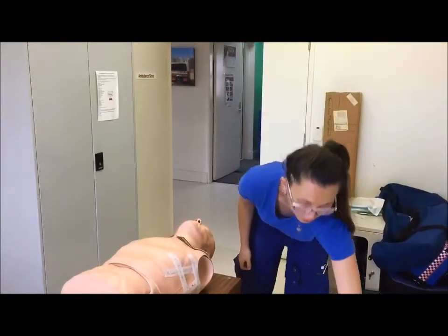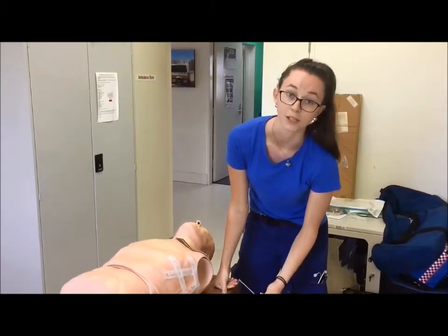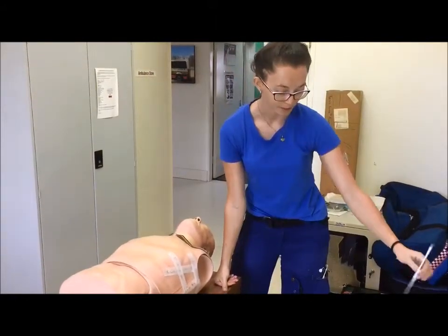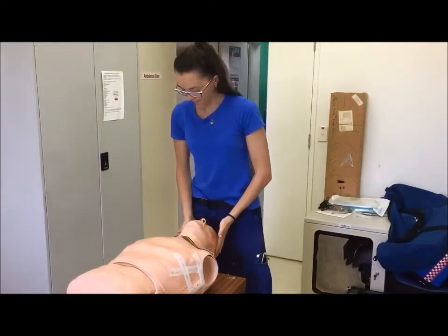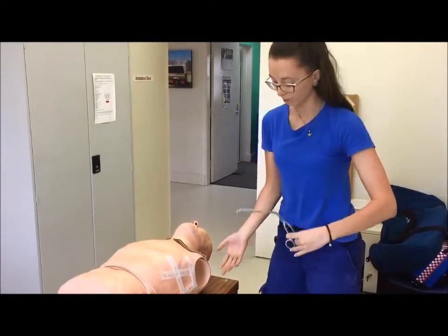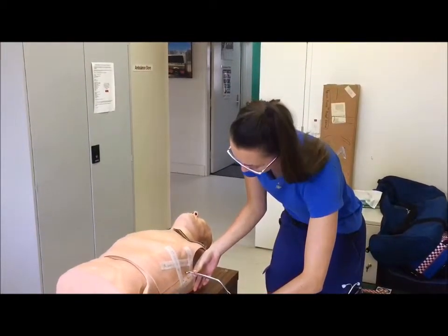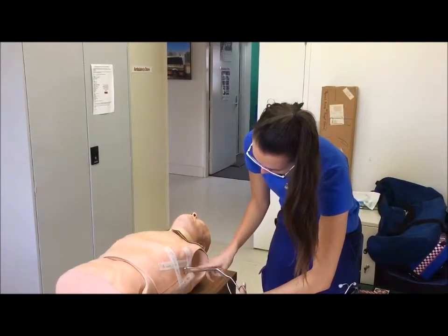Next, with our safety scalpel, we would make a 4 to 5 centimetre incision in the fourth intercostal space, just into the subcutaneous fat. We would then dispose of this in the sharps container. Our non-dominant hand would hold the forceps and push just into the pleural space past the intercostal muscles and make a wide enough incision that we can create a tract for finger insertion.